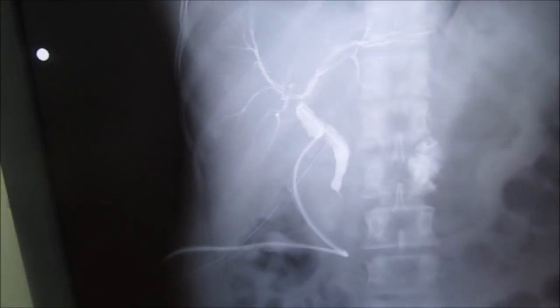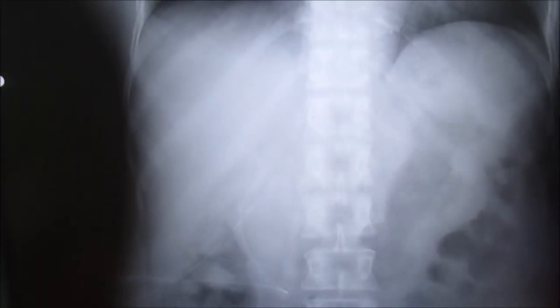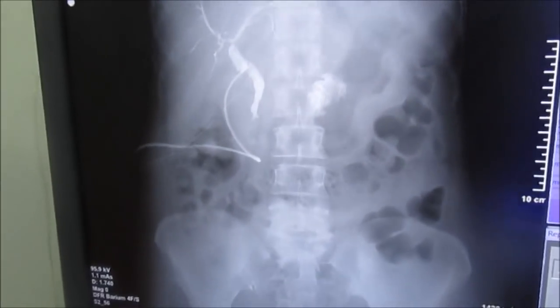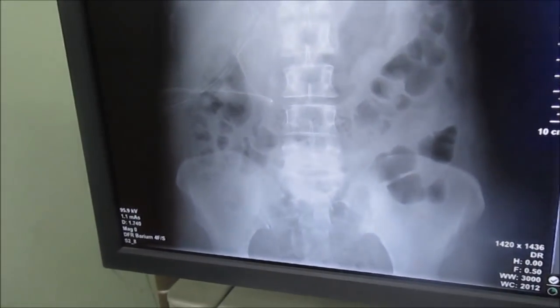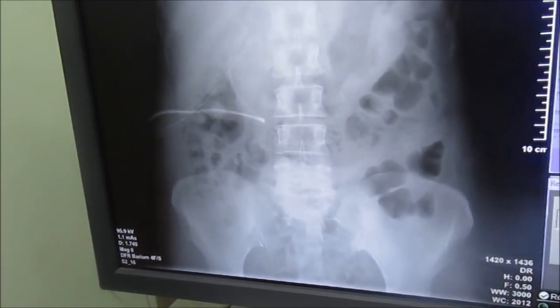In the initial stage, the image will demonstrate the contrast in the T-tube, which will be seen in the common bile duct as well as the pancreatic duct. We can see the contrast spreading throughout both the right and left hepatic ducts superiorly.